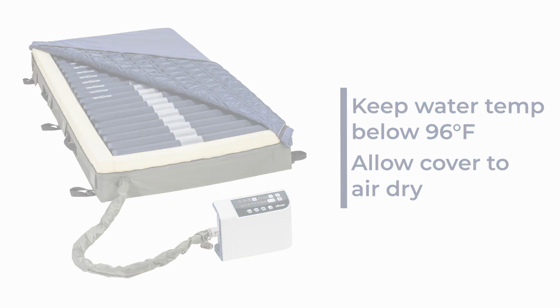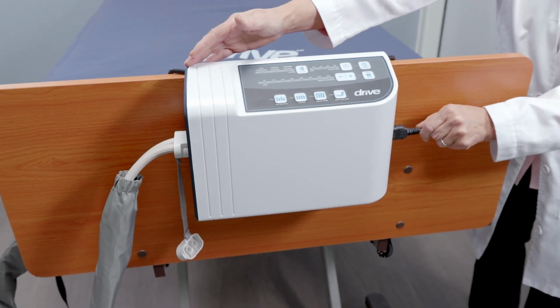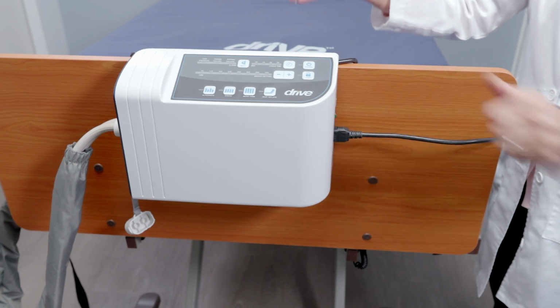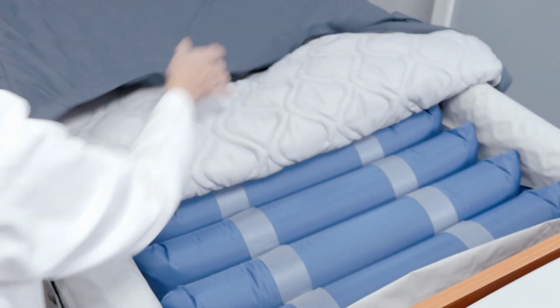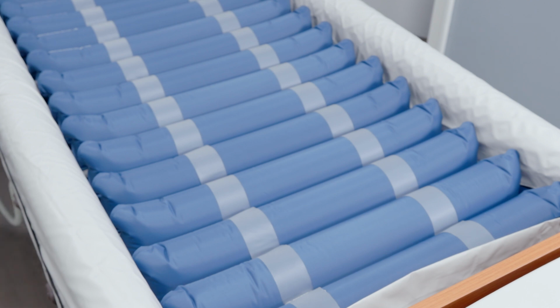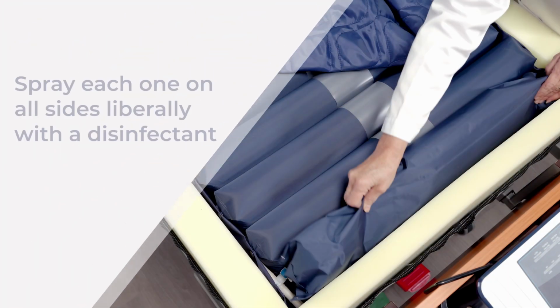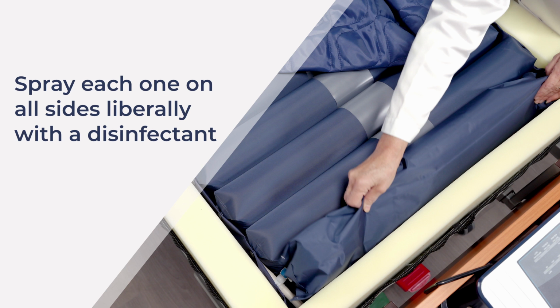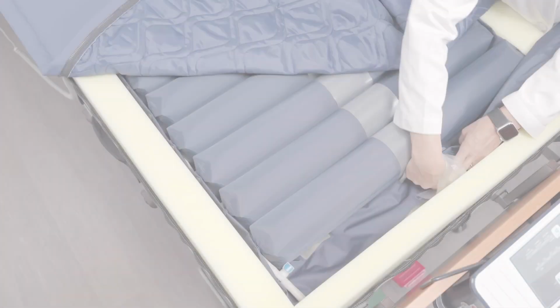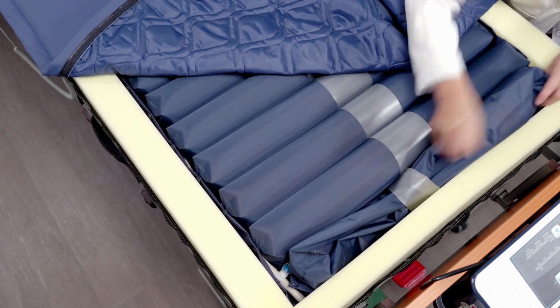For terminal cleaning between residents or when an infectious contagion has been in contact with the Preserve Tech MedAire Edge, disconnect all the individual mattress air bladders or cells from both sides of the mattress and spray each one on all sides liberally with a disinfectant and allow the cleanser to set in or dwell for the detergent manufacturer's recommended time. Allow the cells to air dry, then replace.